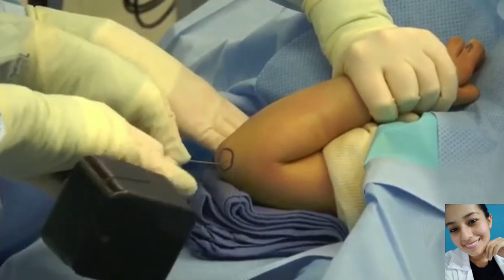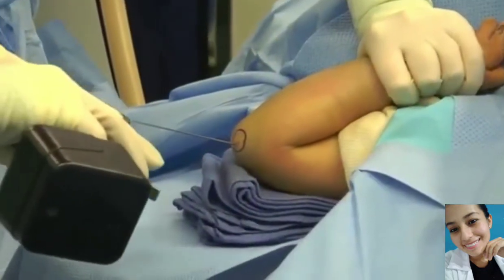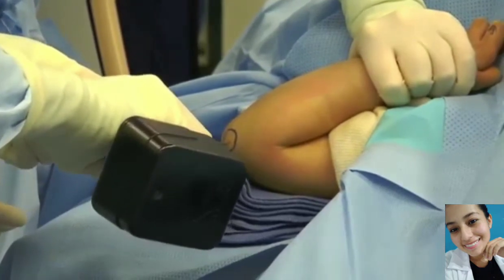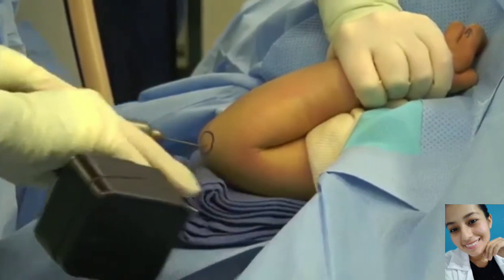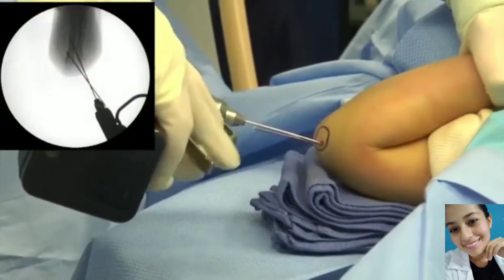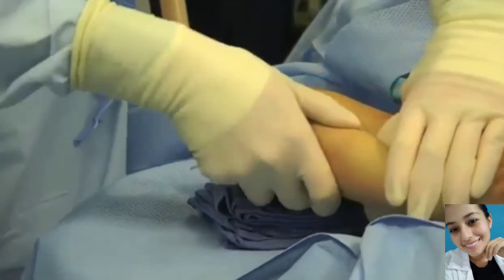The humerus is usually on an incline due to the towels underneath the humerus, and this needs to be considered when placing the pin trajectory. The pins are passed until such time as they have bicortical purchase. Sometimes they will pass across the olecranon fossa and encounter 4 cortices. A second pin is then also placed, and again fluoroscopic confirmation is performed in the anterior-posterior as well as the lateral position.